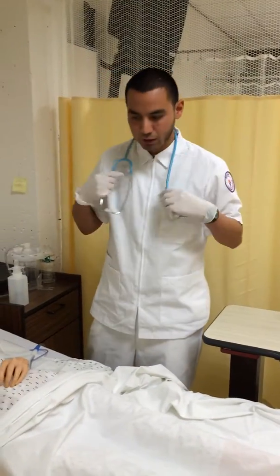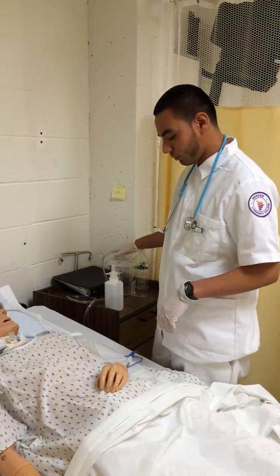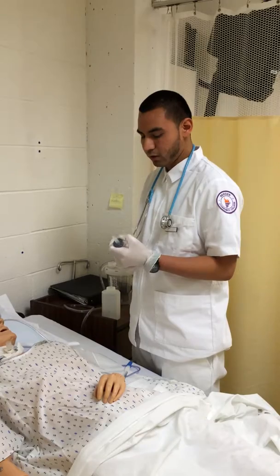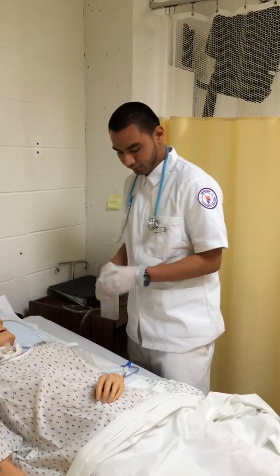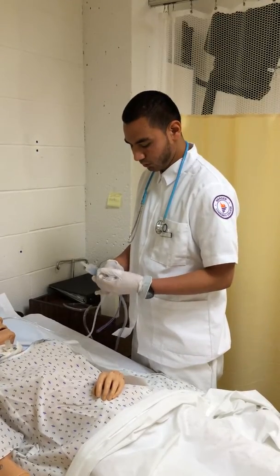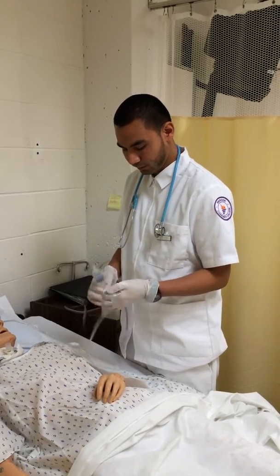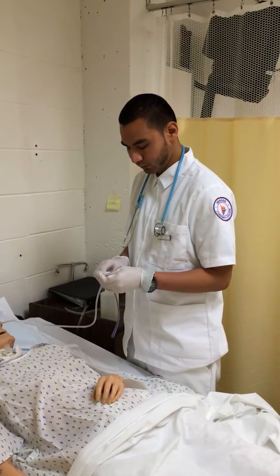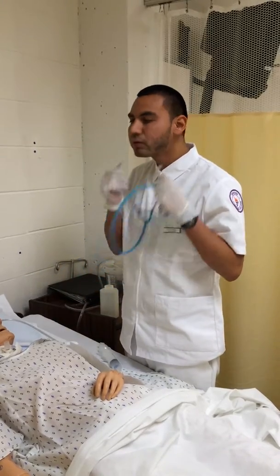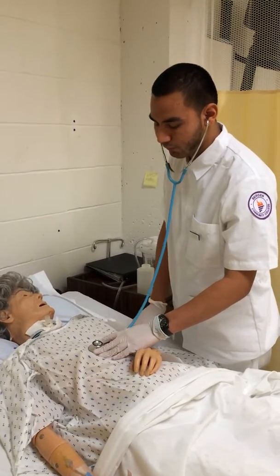The next step is to check if the NG tube is properly placed. You want to turn the pump off, and you need to get 30 cc of air. You just want to disconnect the tubing. While you're doing this, you want to place your stethoscope a little bit left of the xiphoid process.